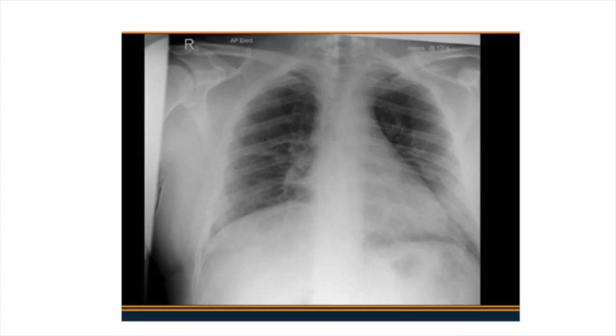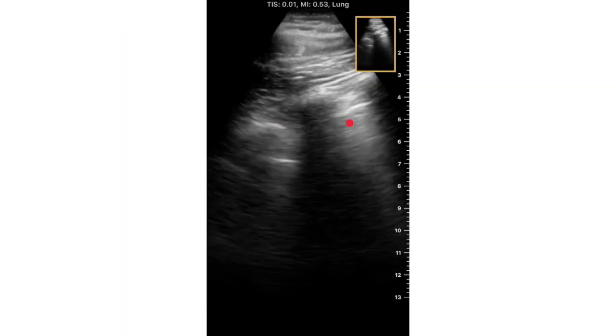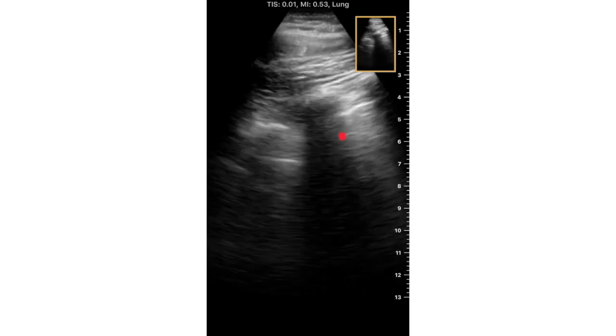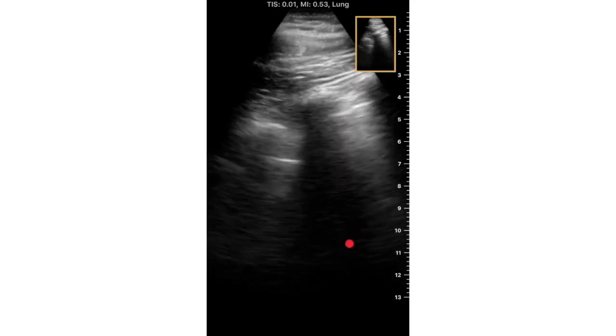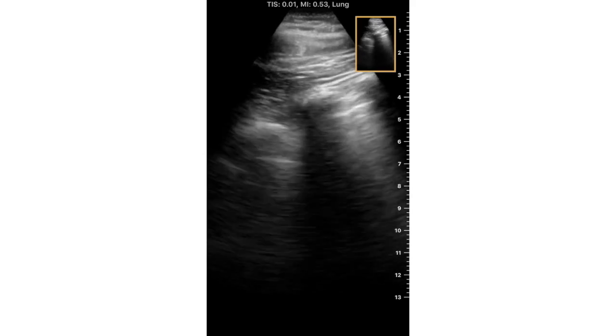But we will beat COVID and there is recovery, and when I see these patients I get very, very happy and excited when I start scanning patients and I can see signs of recovery. This is a professor in engineering and he was really sick when he first came in. You can see there are bilateral changes and infiltrates, and you can see he's developing his A-lines, they're coming back. He's still got B-lines, but he's getting his A-lines back, which is very reassuring.